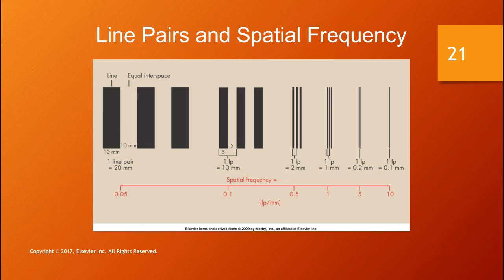In digital imaging, recorded detail, commonly called spatial resolution, is determined primarily by your matrix size, your pixel size, and your grayscale bit depth. We're in the digital imaging processes now. So when you're thinking of digital imaging and you're looking for recorded detail, and you know it is determined primarily by matrix size, pixel size, and grayscale bit depth, you are looking at the X, Y, and Z axes of that digital image.